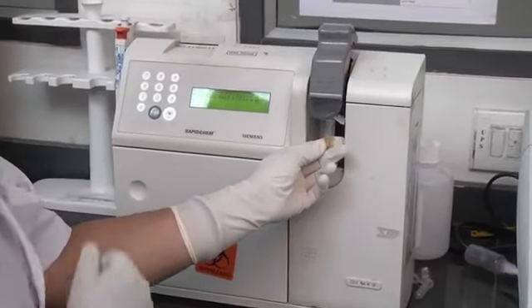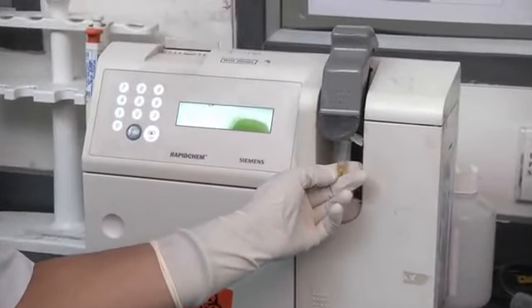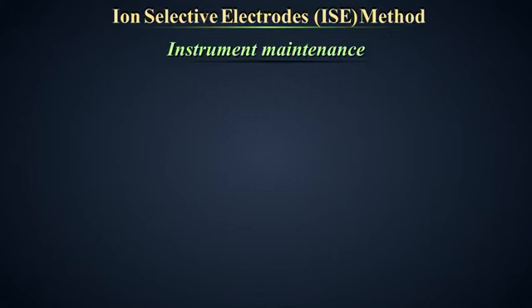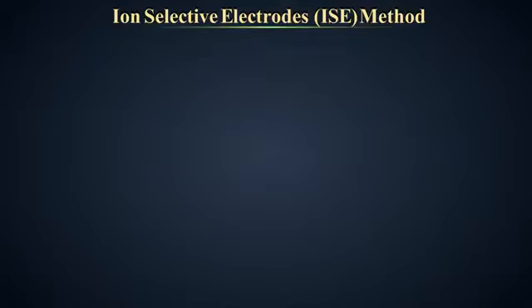Run the cleaning solution like a sample, but in the daily cleaner mode. The cleaning cycle will be completed in 75 seconds. After cleaning, calibration is required before samples can be analyzed. This instrument performs an automatic calibration and is then ready to analyze samples.